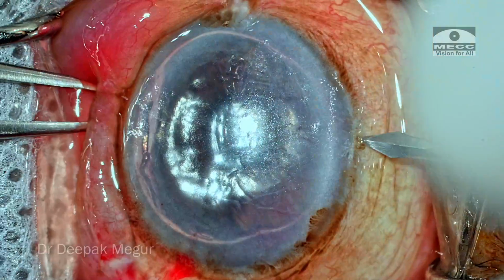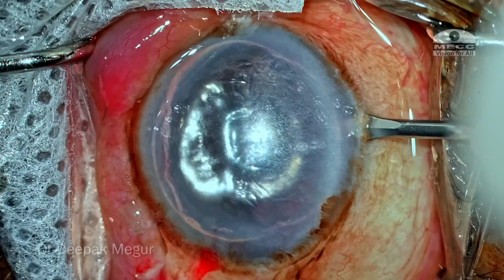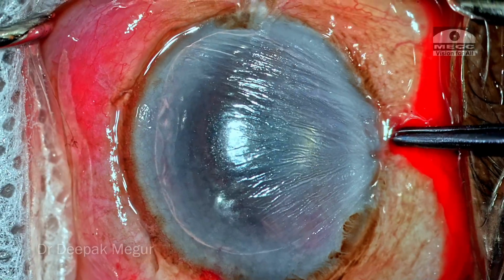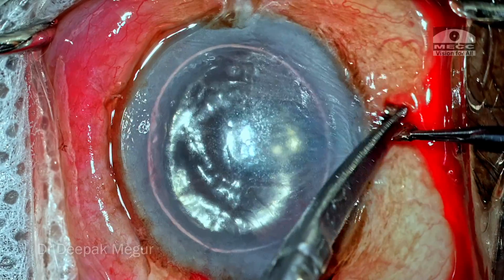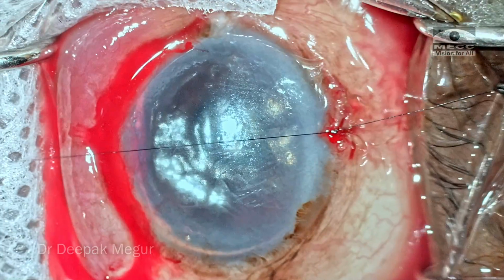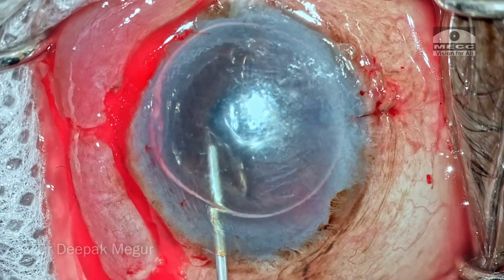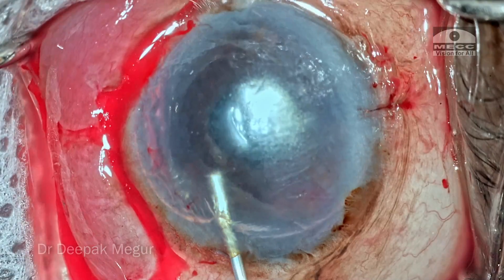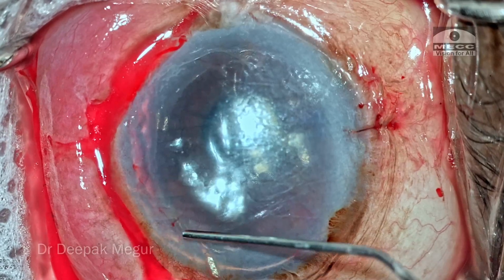To do an inferior iridectomy, I'm making a stab incision at the 6 o'clock position. This incision has to be very short. We want a very small corneal length here so that we can access the iris very easily. The iris is held, a small iridectomy is done, and the incision is closed with a suture, and that's it. I'm patching the eye and asking the patient to lie down as much as possible, and the chamber is again refilled with the same gas. I just want to maintain the pressure for a little bit more time. After maybe 5 minutes, I let out the air a little bit.